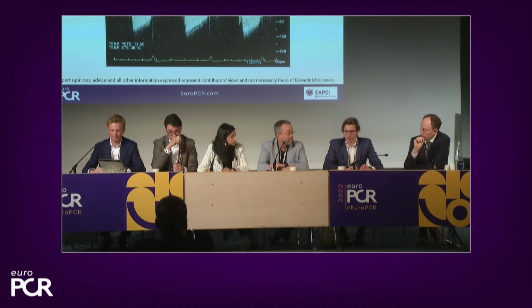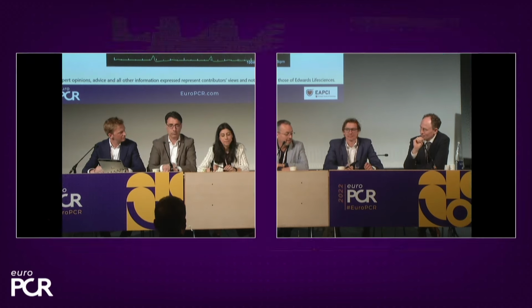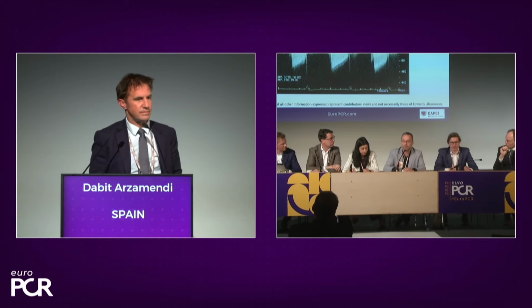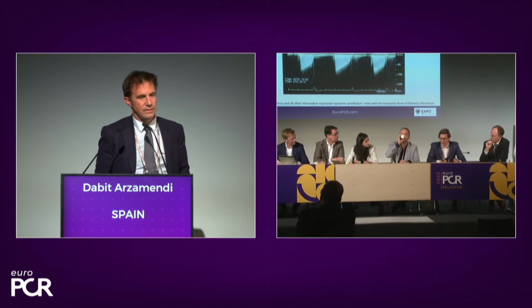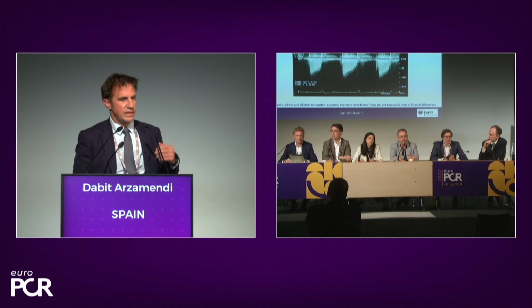Yeah, thank you. We have a few seconds left. So what is the minimum leaflet insertion you accept for this deep ventricular grasping? What was the leaflet insertion in your last case? Yeah, that's what we've been discussing before. And the company suggests that it has to be at least 5.